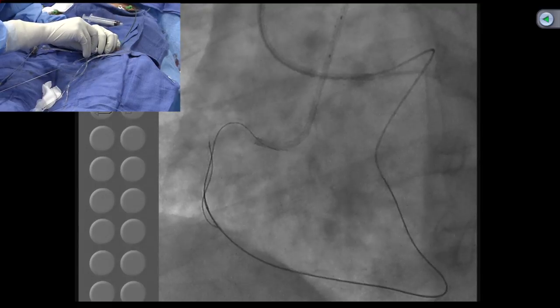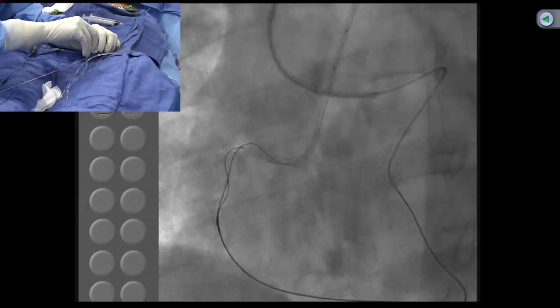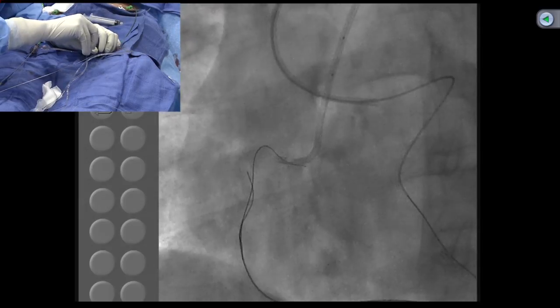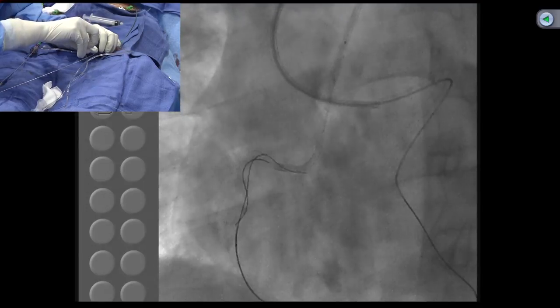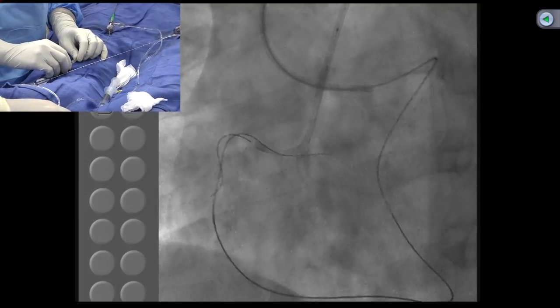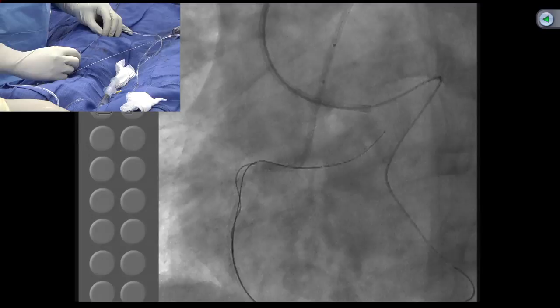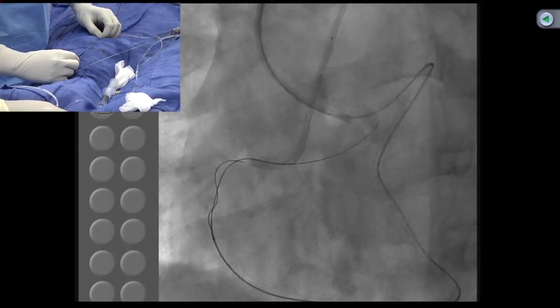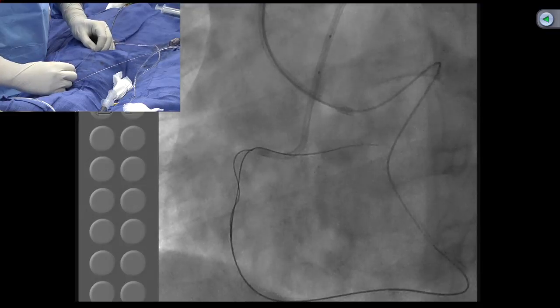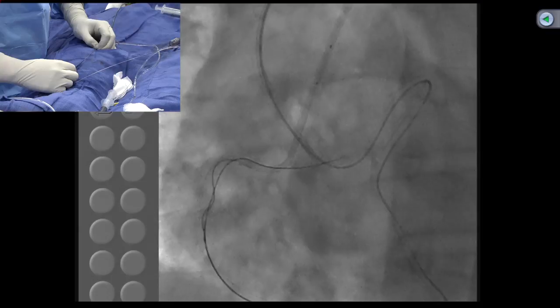Now this is a very key point: now that the Corsair has created a lumen, you have to pull back the Corsair if you are trying to integrate. Otherwise it will not go. So you want to follow that channel, or you will have to work quite a bit proximally to get the wire into the guide catheter. But I think you pull back the Corsair. There's nothing wrong in that. I think there's some amount of subintimal channel there. I think we should just exteriorize it.